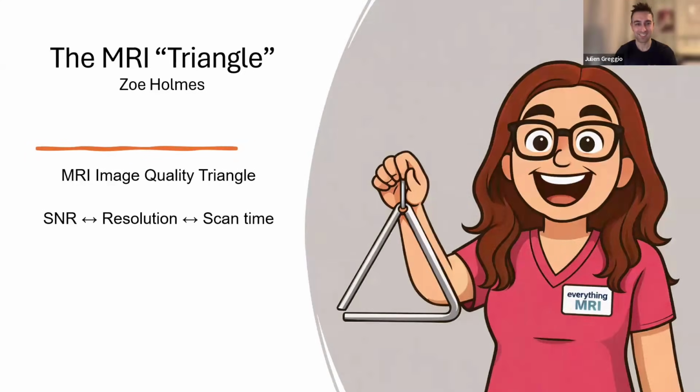Excellent. Alrighty, so everyone, today we're here to make MRI image quality feel predictable rather than mysterious. This whole session is built on one practical idea: image quality is a three-way trade-off between the signal-to-noise ratio, the spatial resolution, and the scan time. If you push one corner, say you want thinner slices or a bigger matrix, you're usually going to have to pay with either one or both of the other corners. Images become noisier, or the scan becomes longer, or both.